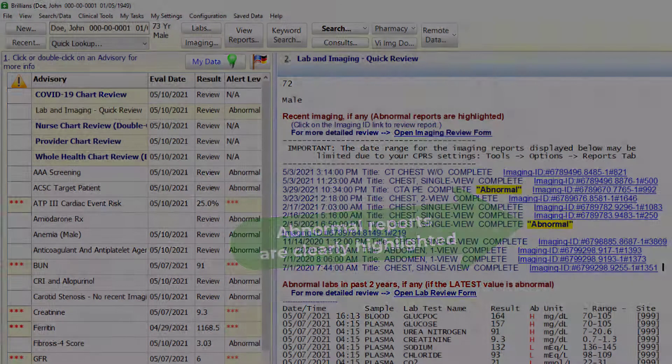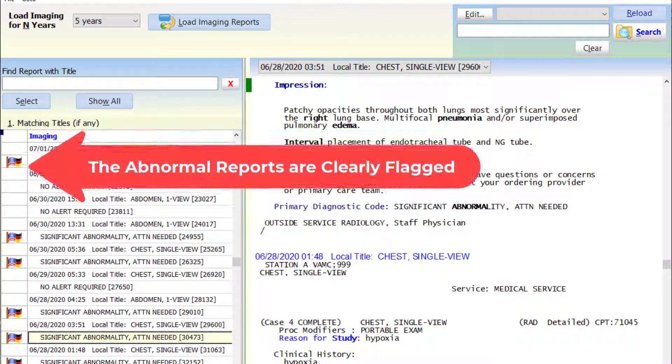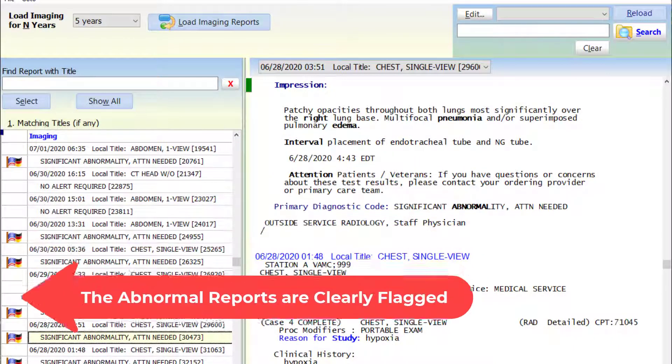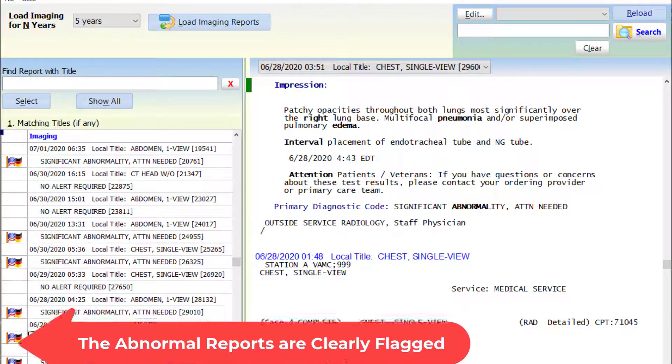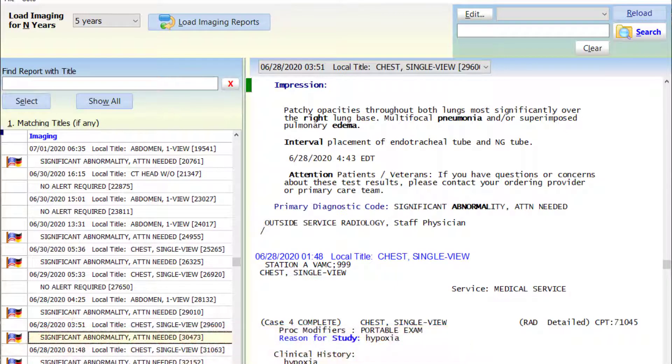Two, the dedicated imaging review feature clearly flags the abnormal reports and facilitates efficient review. Of course, no software can substitute for the due diligence on part of the provider.